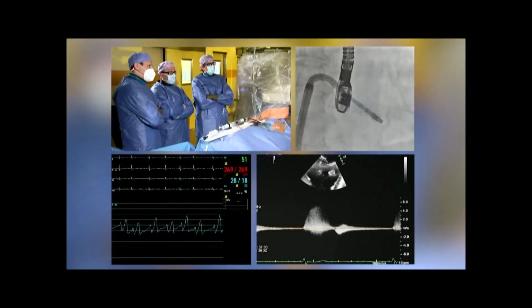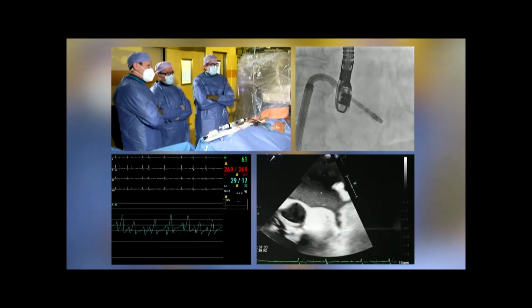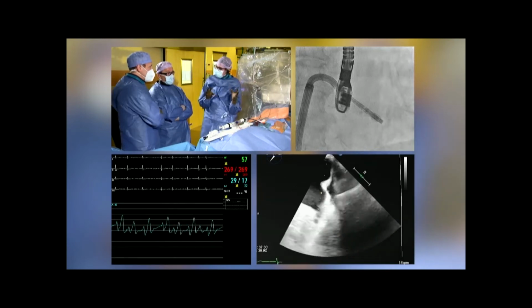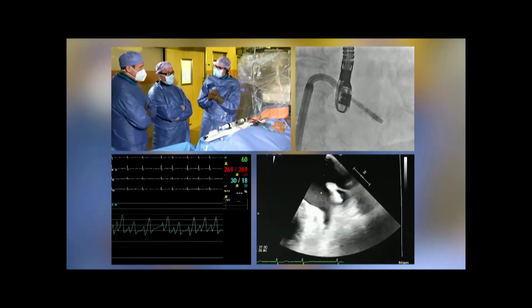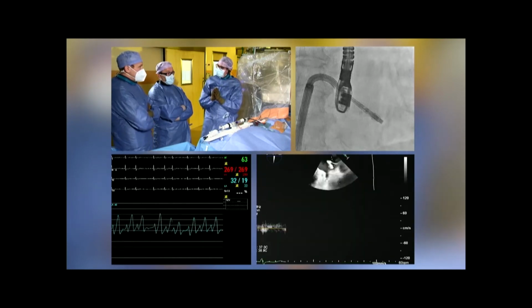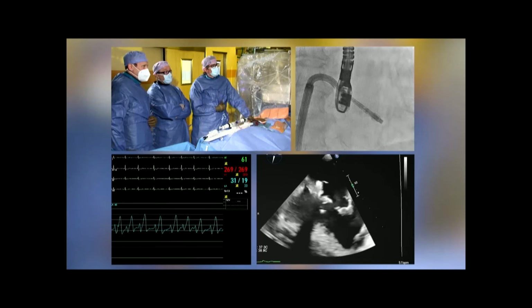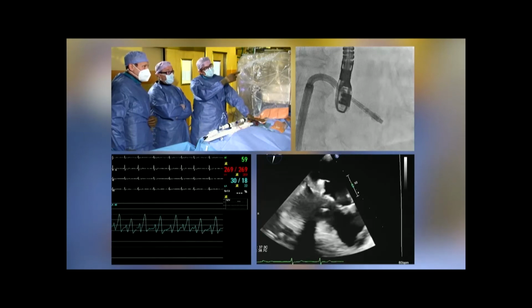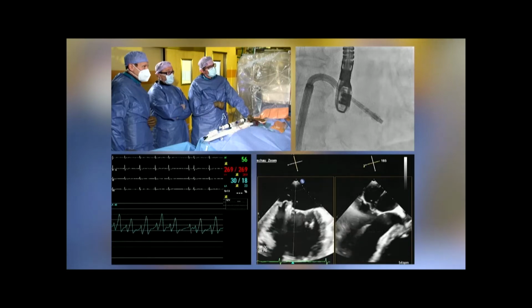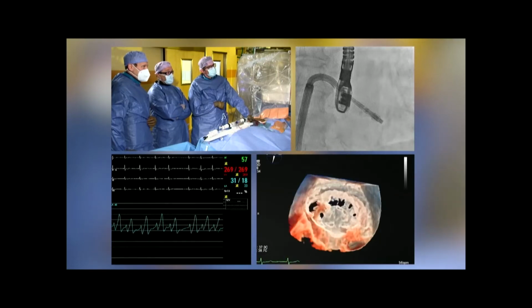The hemodynamic effects tell you that you have a perfect result. Yeah, from a morphology, anatomy point of view, would think that we add another one to stabilize it, but then you would like to have this one to be even more medial. I totally agree. Of course, we have the mitral valve orifice is large enough, so we can still place a second one without having a significant gradient.